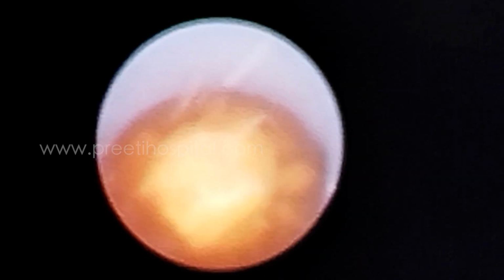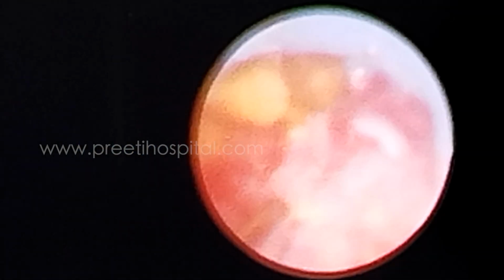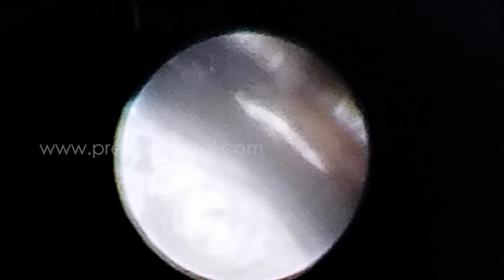And if you do posterior puncture, supine PCNL, the drainage of the fragments will not be that good. Give me forceps. If you do more posterior, more anterior drains better. That you remember. Got the point? Because it is in line with the pieces you should remove. See, if you do all this, this is not correct. They might have migrated into upper calyx. So that's not good.